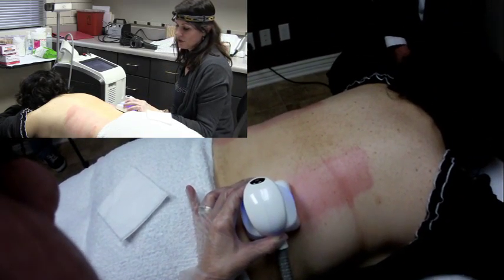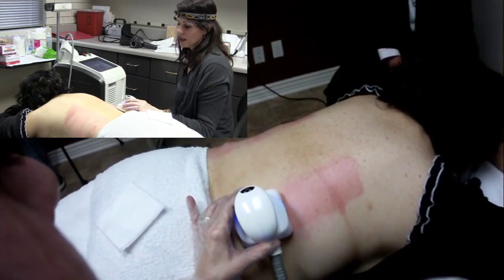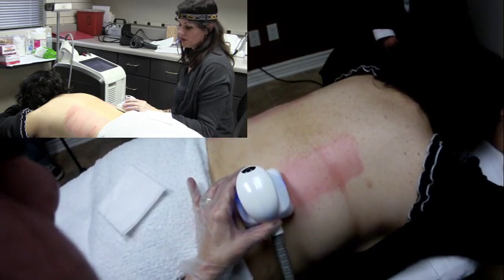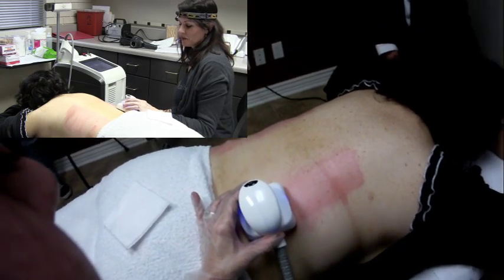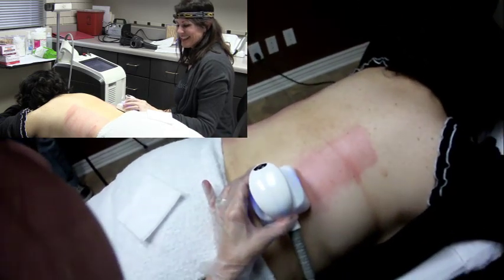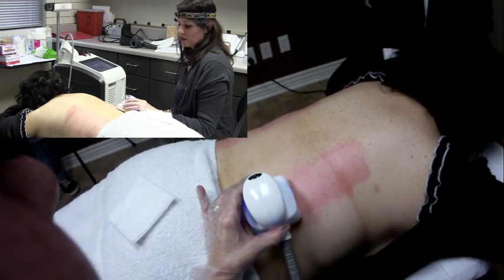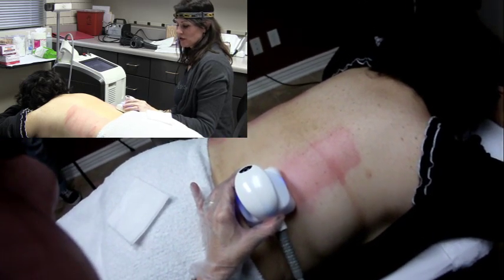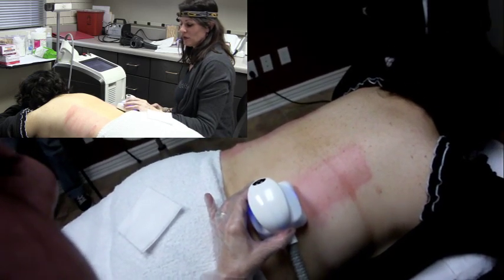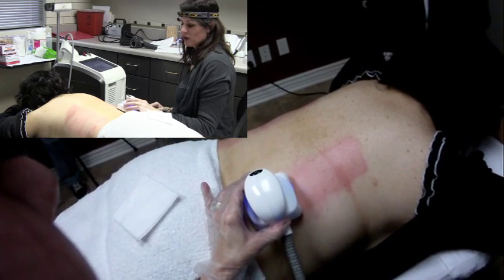As I go through the area we're also doing about 10% overlap. I want to introduce the heat to her gently and then increase the heat as her body can tolerate it. This is a two-treatment process — basically what we're going to do is this treatment today, and then four weeks from now we will do a second treatment. We did take pictures of our client ahead of time, and what we're looking for is a reduction in fat in the area that we're working.